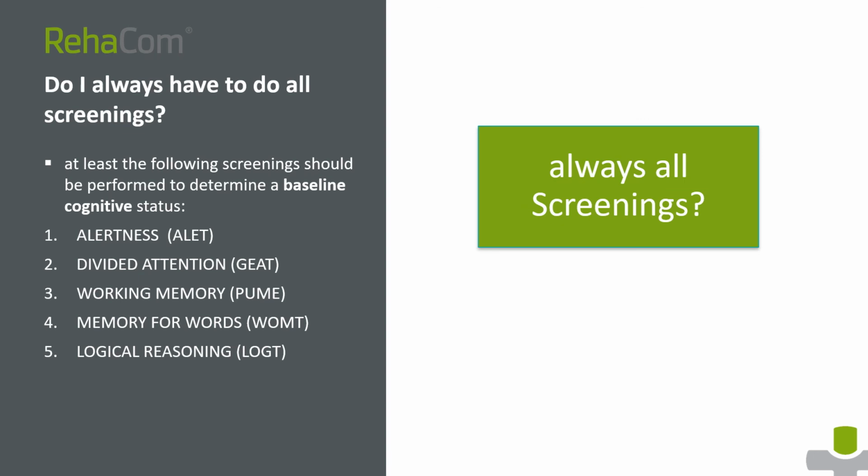To the next question, do I always have to do all screenings? At least the following screenings should be performed to determine a baseline cognitive status: alertness, divided attention, working memory, memory for words, and logical reasoning.